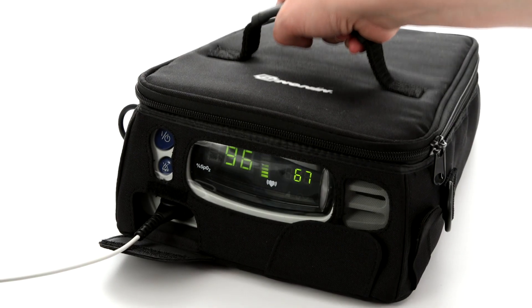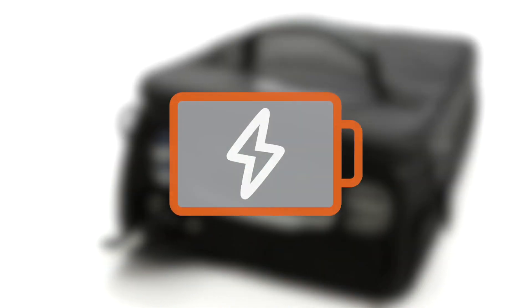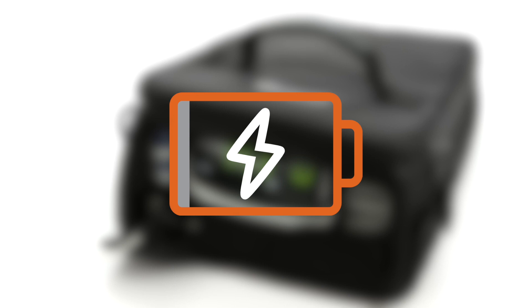Recharging takes about 4 hours when the battery pack has been depleted. The 16-hour battery life allows the NANAN 7500 to be used as a portable oximeter when needed, for example in transit, and provides peace of mind during power outages. The low battery indicator will blink when the battery is getting low and stay on continuously when critically low. Recharge the battery as soon as possible.